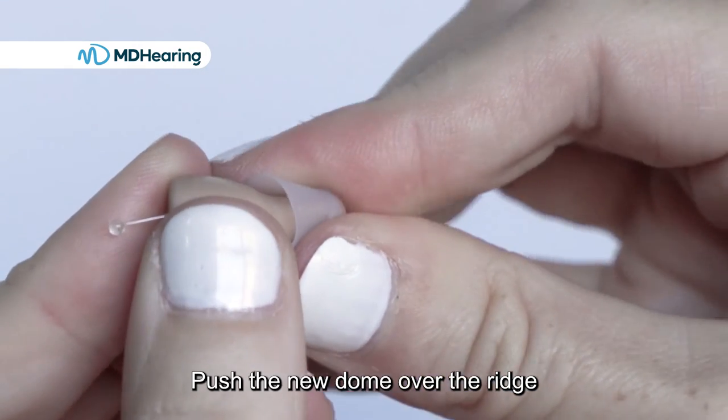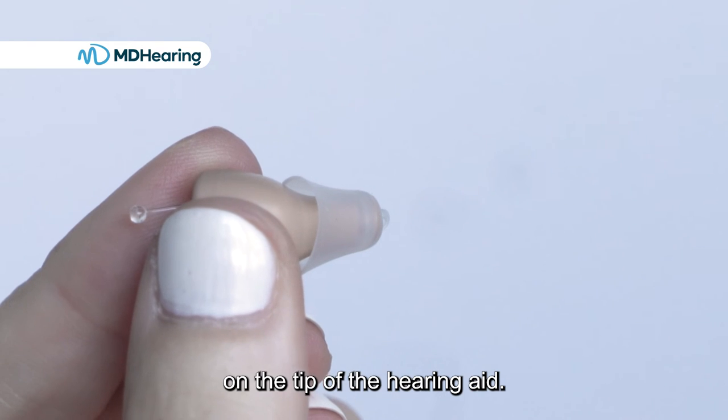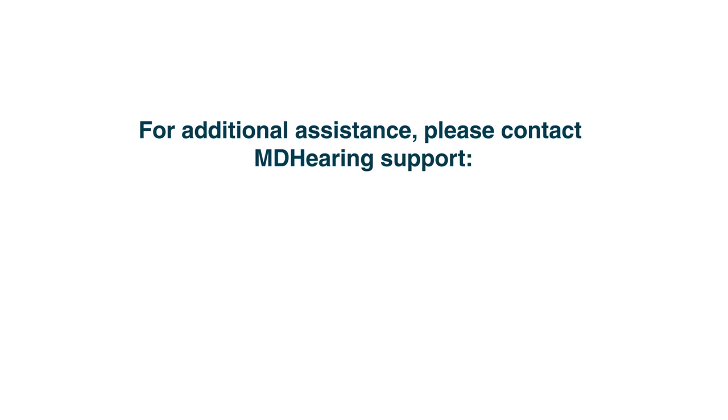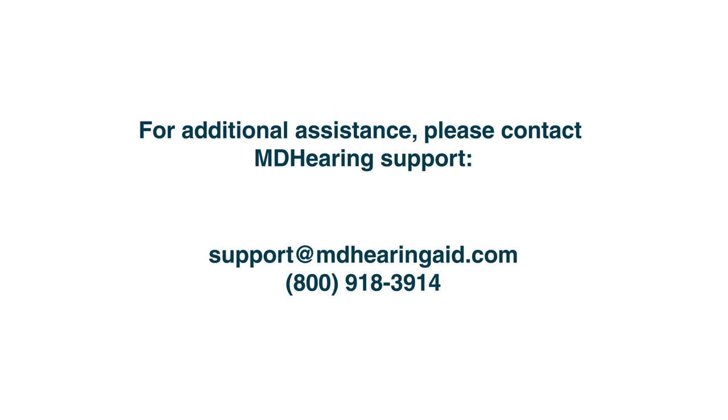Push the new dome over the ridge on the tip of the hearing aid. For additional assistance, please contact MD Hearing Support at support@mdhearingaid.com or by calling 800-918-3914.